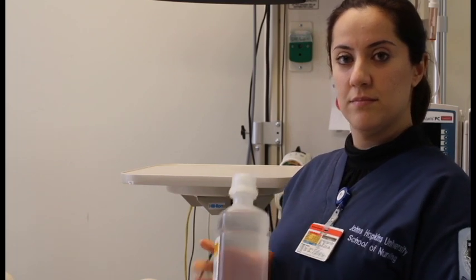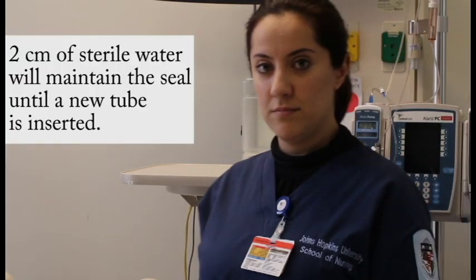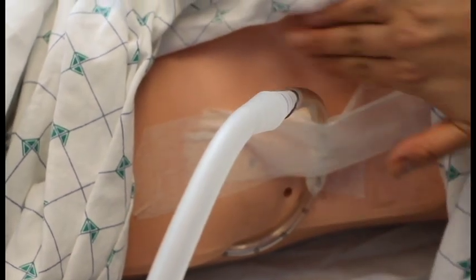A bottle of sterile water should always be kept at the bedside in case the chest tube becomes dislodged. You can always put the tip of the chest tube into the sterile water to keep it clean. The insertion site should be kept clean and dry. Palpate the area and note any crepitus.